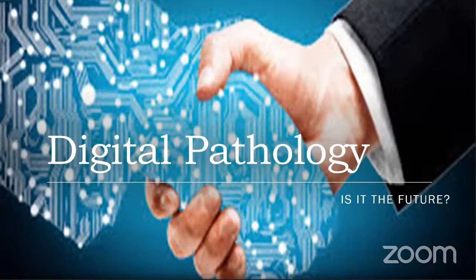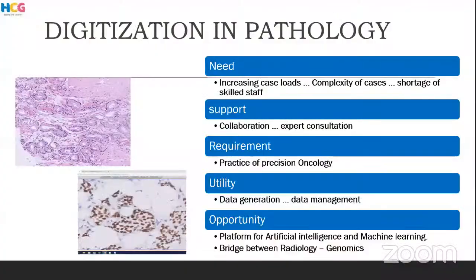So the digitization in pathology does not just end with scanning a slide and generating a whole slide image, viewing it on our desktops and then just signing out the report. This actually involves a wide workflow, which includes orienting the people, then evaluating the systems, successfully implementing it, and also making your clinicians aware of the advantages that digital pathology carries.